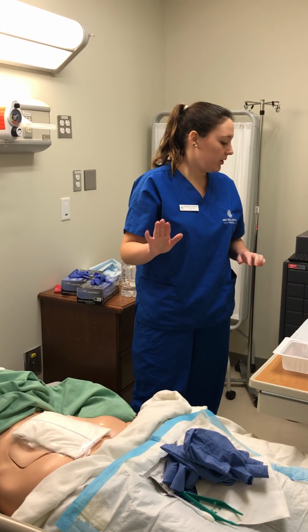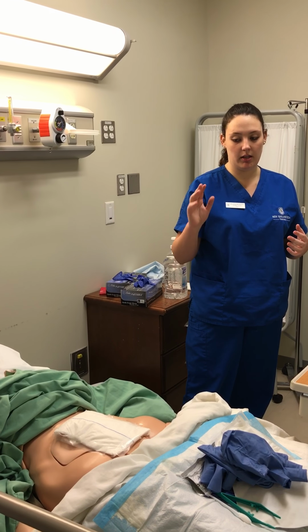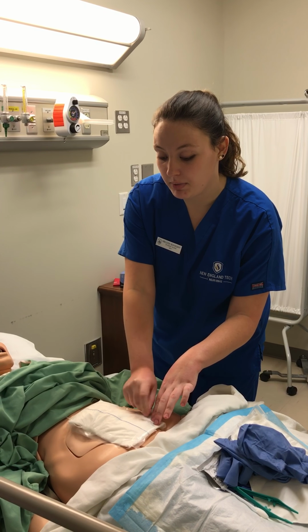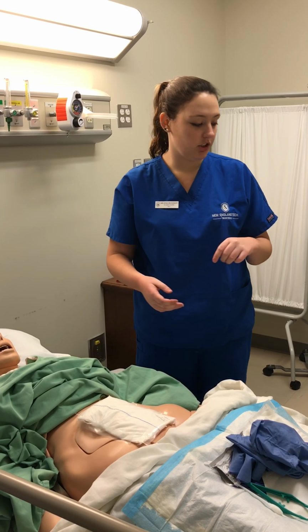Now, very important step to this is you want to date, put the time, and put your name on the dressing. This is for the next nurse to know. You can do this on a separate piece of tape and then place it on. Do not write on the bandage. It's going to cause more pain to the patient.